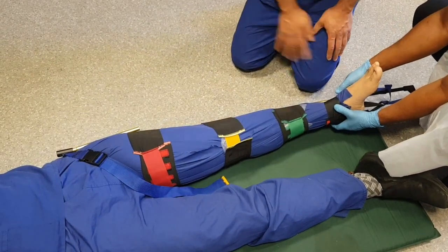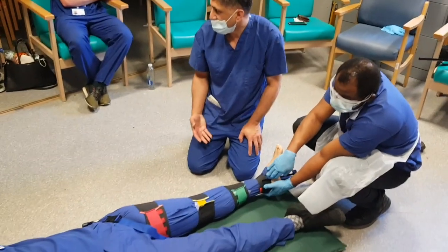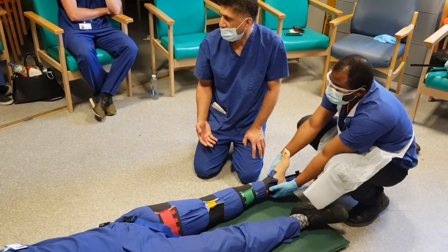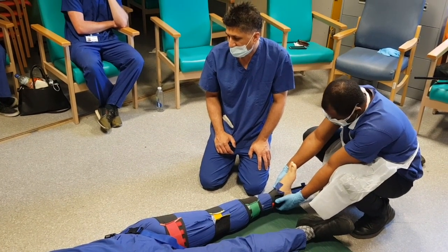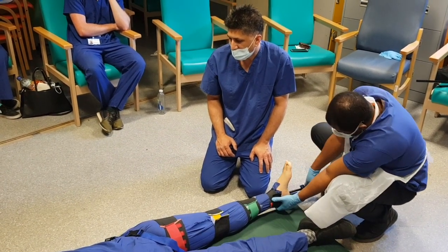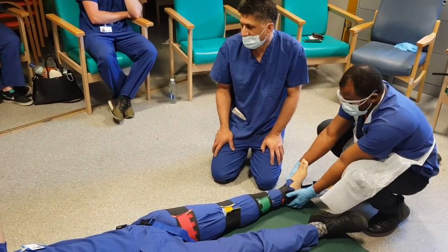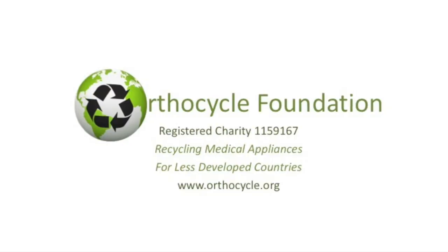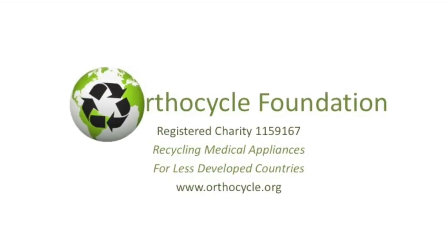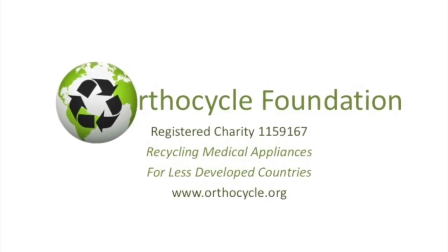Once I've finished, I'm going to check his neurovascular status again. The Kendrick traction splint is used quite commonly by the ambulance service to apply to femoral fractures before they come to hospital. Once you get into hospital, you would want to change this for a Thomas splint as soon as possible. If you're interested in our videos and the work of the Orthocycle Foundation, you can visit our website, and if you wish, you can make a donation.